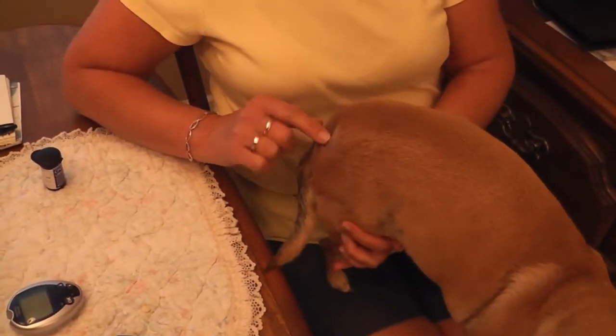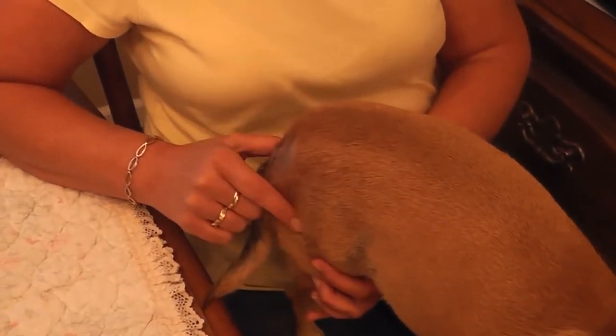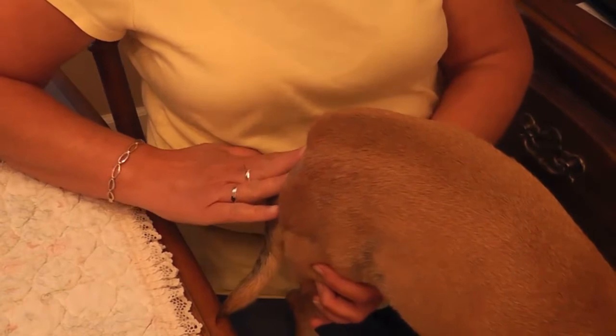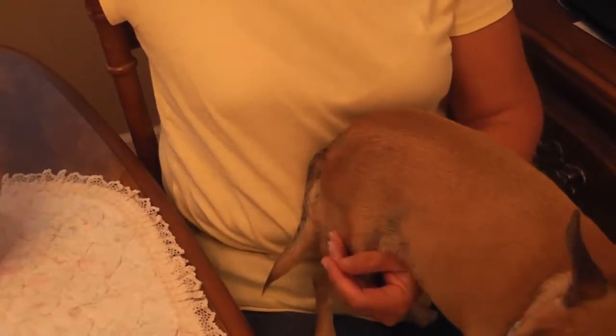There's a little area on her butt shaved right here on the side, just to the right of the base of her tail. Don't pay attention to this — she's chewed on it from her allergies.